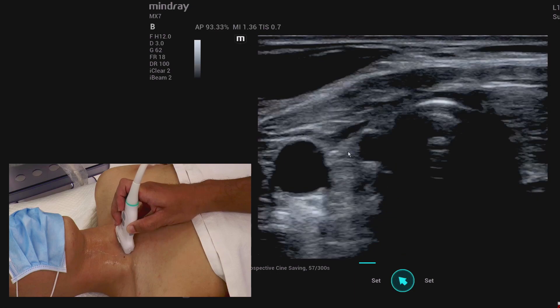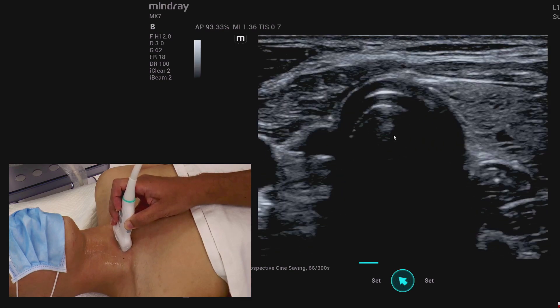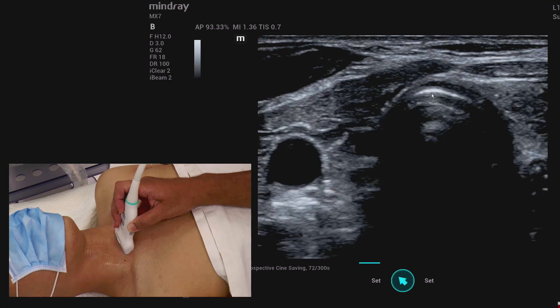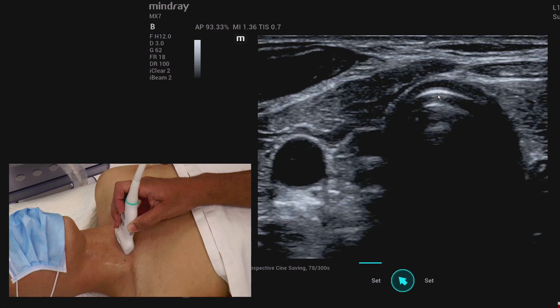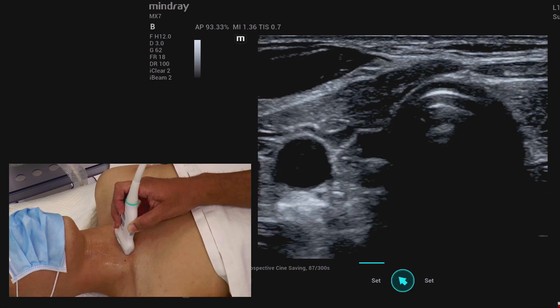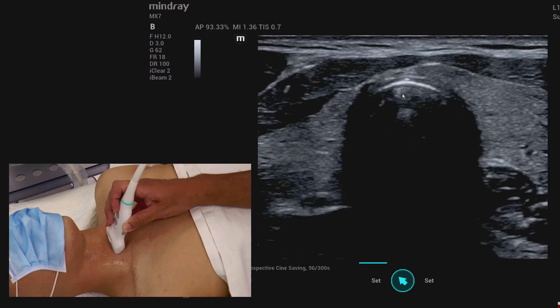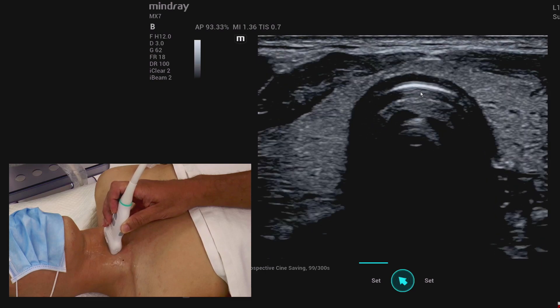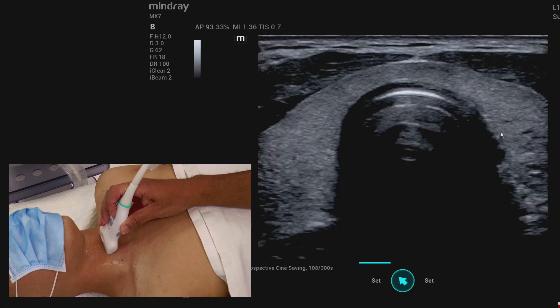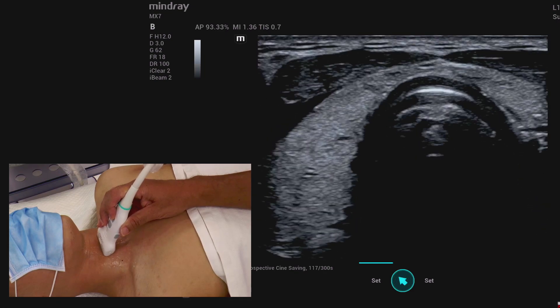Coming back to the central point, what we are seeing is the trachea and part of the thyroid gland. The most superficial hyperechoic line is the air-mucosal interface — that is where the mucosa is. The other lines below it are artifacts — reverberations. As we move cephalad, the thyroid gland becomes more prominent. The thyroid gland is homogeneous unless you are dealing with a pathological thyroid gland. Moving further up, you will see the tracheal rings appearing in and out.